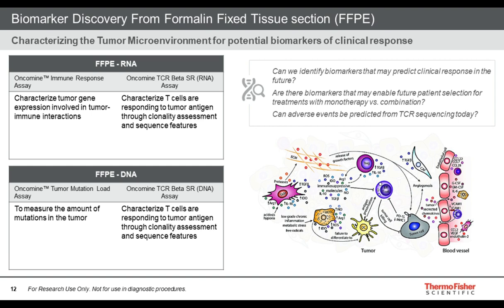I'd like to add some comments here also on the use of RNA versus DNA as input to the short-read assay, since the assay is compatible with both types of input. Where FFPE sample quality permits, if the DNA isn't too degraded and the RNA isn't too degraded, we believe that working with RNA has some advantages. One advantage is that for the same total input mass, use of RNA rather than DNA will typically yield a better and broader representation of the underlying repertoire, because to begin with, the source material is itself more targeted.